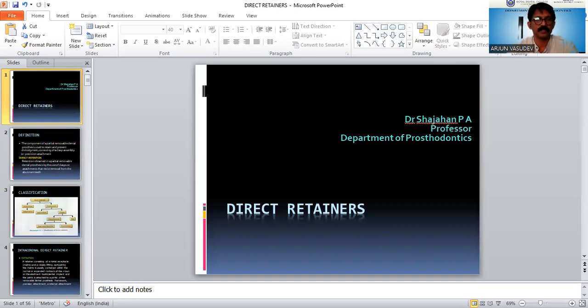The retentive terminal should point towards the occlusal surface and never towards the gingiva. The retentive tip should only terminate in the mesial or distal line angles of the tooth, never in the middle of the facial or lingual surface. So the clasp arm should be kept as low as possible to gain mechanical advantage against any lever action on the tooth.